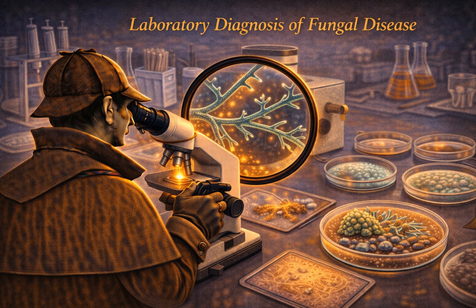You aren't looking for free-floating mold, you are looking for a macrophage, a big host cell that is absolutely stuffed full of tiny blue-purple oval yeasts. The swarm inside the cell. Exactly. It looks like the macrophage has the measles. It's also useful for identifying pneumocystis cysts in respiratory samples, but the histoplasma macrophage connection is the one that shows up on board exams constantly.